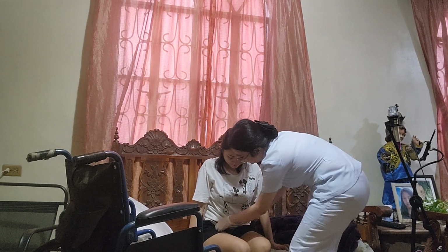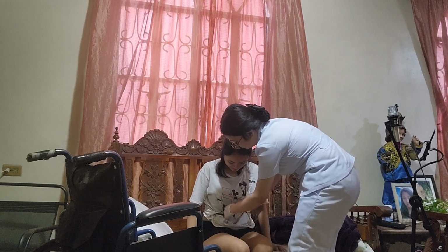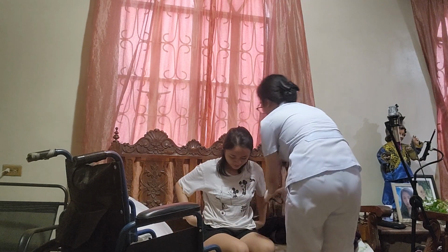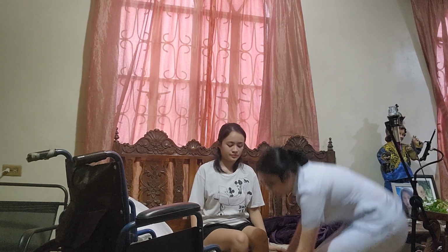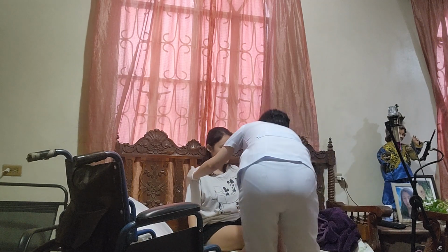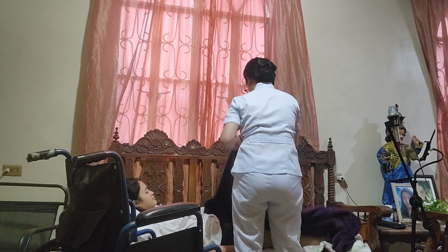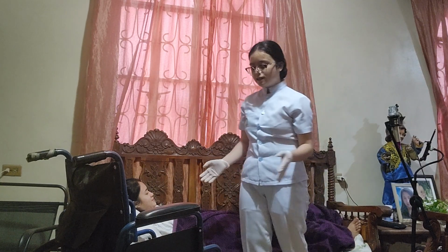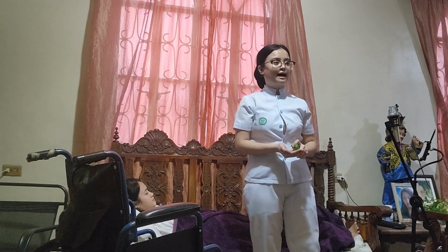And remove the gait belt. Then of course, you will need to remove the patient's slippers and then place the patient in a comfortable position, and then remove gloves and perform hand hygiene.